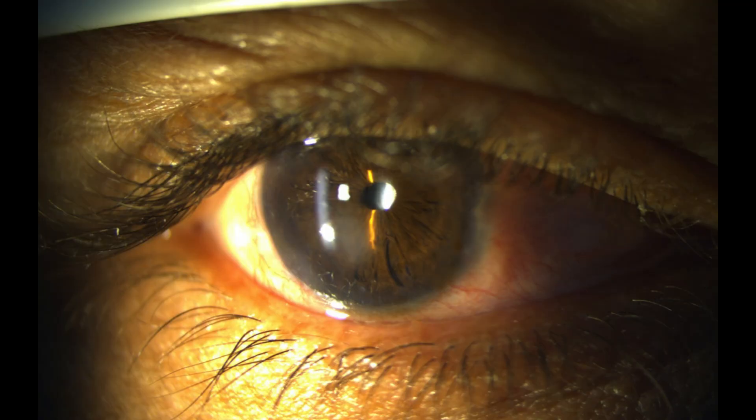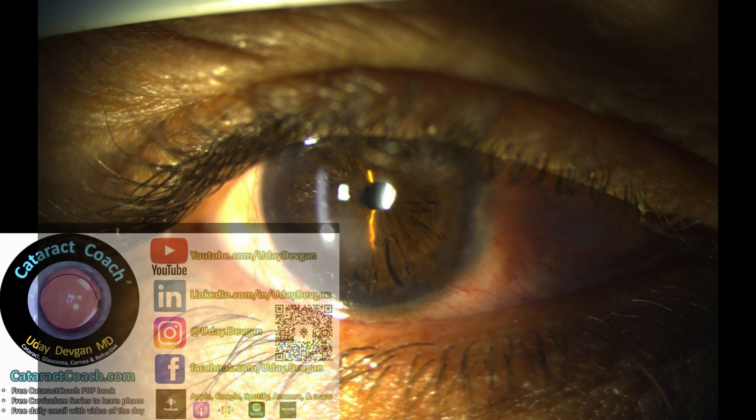Here's some viscoelastic. Here's the pre-op look: you can see there is definitely a white cataract, a small pupil, and look at the gap between the iris and the lens. That gap is very important.